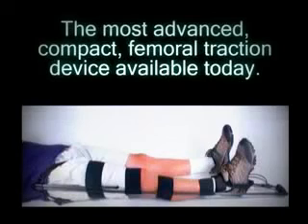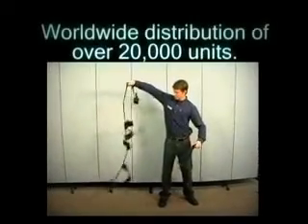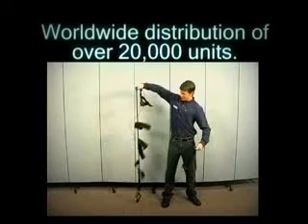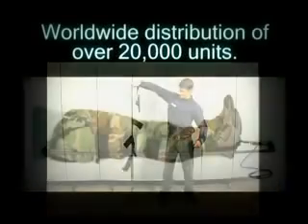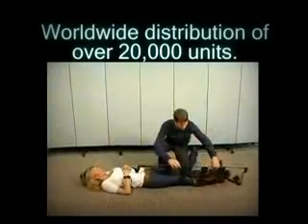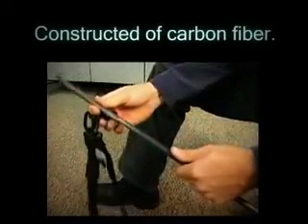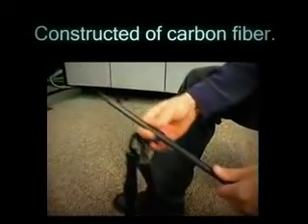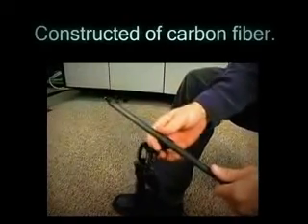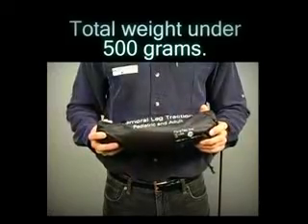You are about to be introduced to the most advanced compact femoral traction device available today, the CT-6. With worldwide distribution of over 20,000 units since its introduction, it has proven itself as a sturdy, reliable piece of equipment both in battle and in the civilian markets. Constructed from carbon fiber, a material which has the highest strength to weight ratio of any high-tech construction materials in use today, helps to bring the total weight of the splint in at under 500 grams.